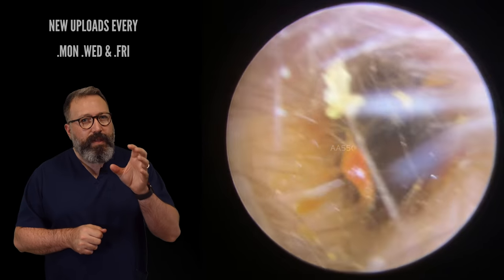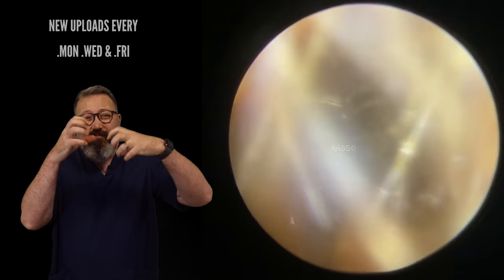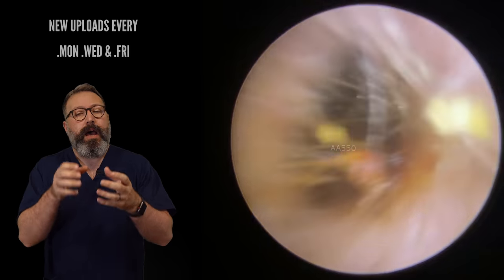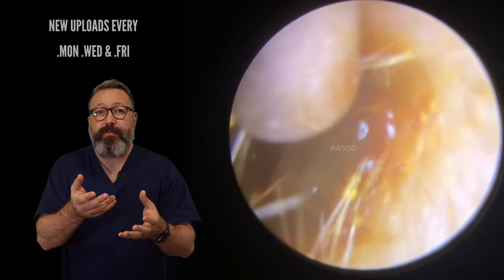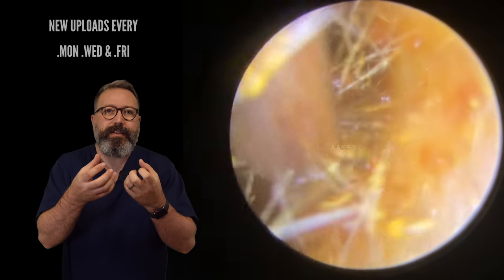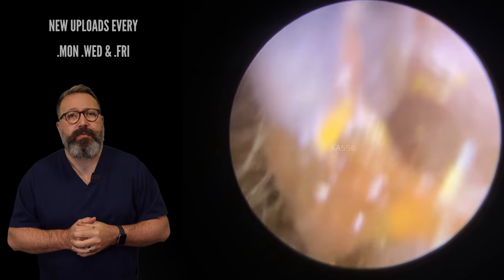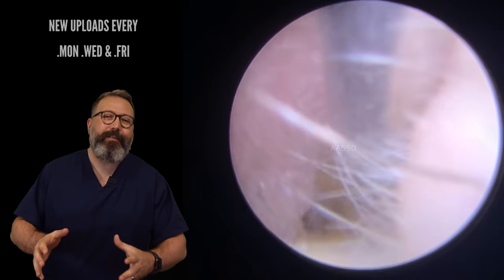Oh, there it is — there we go. This patient came through with lots of really dense cilia around the outside of the ear canal. It's like a little forest in there. The wax itself has a lot of these tiny little hairs. This patient has been trimming their ear hairs and those hairs come away, lodge in the ear canal and get embedded into the wax. So we end up with these really hairy wax clumps coming away. Now, I know a lot of you are going to be screaming that you should trim the ear hairs.